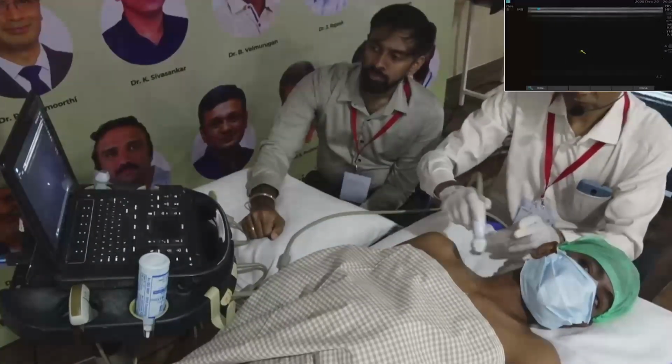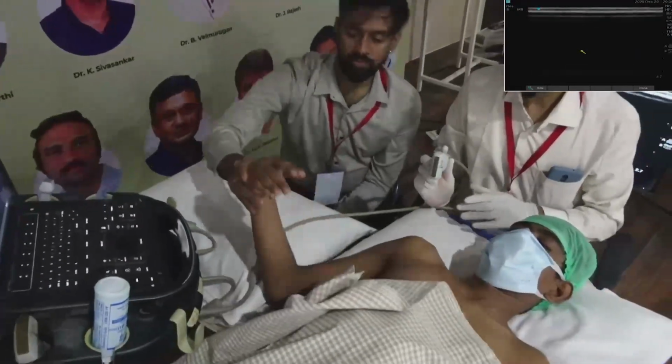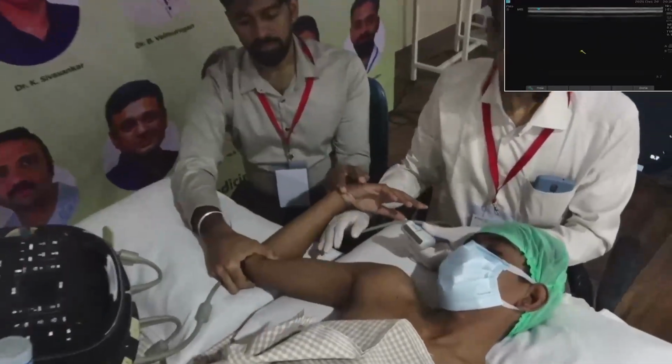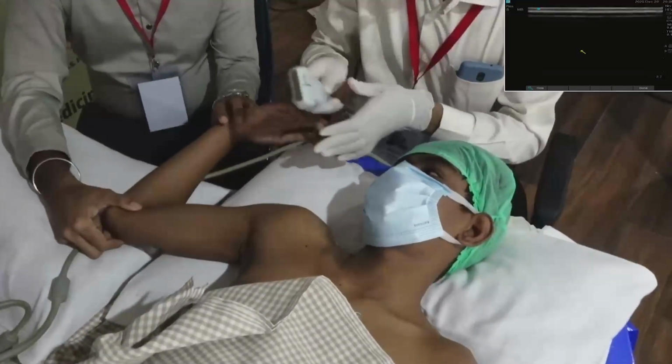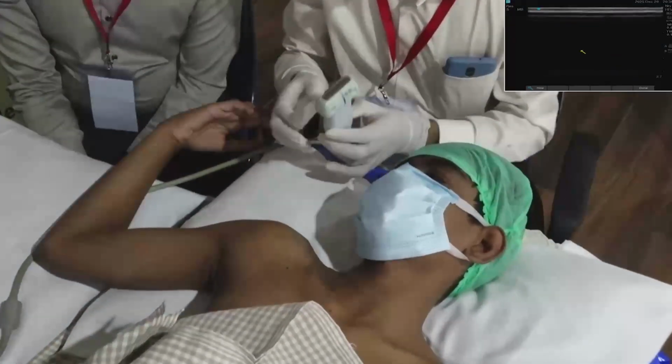So now I will move on to below the clavicle. Below the clavicle, the requirement is to abduct the arm, but in fracture patients sometimes it is not possible. But the more and more you abduct it, it is going to be easy.